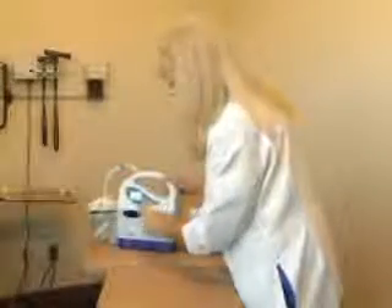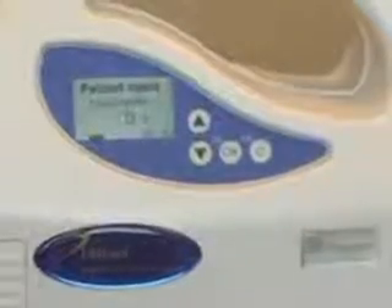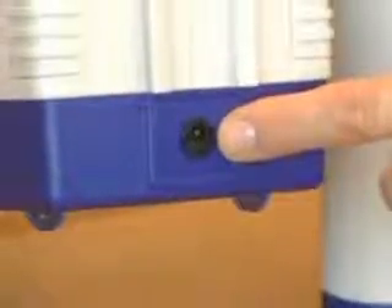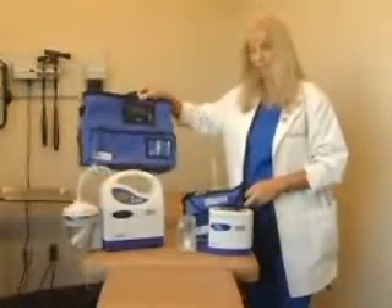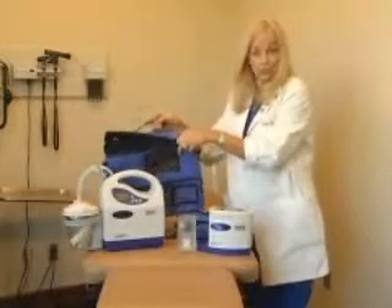On the display screen in the lower left-hand corner, you will see the battery indicator. If the unit is plugged into the wall on its external AC adapter, you would see the prong icon in place of the battery indicator. The Pro 3 also comes with a carrying bag, which can be carried over the shoulder or attached to a wheelchair.